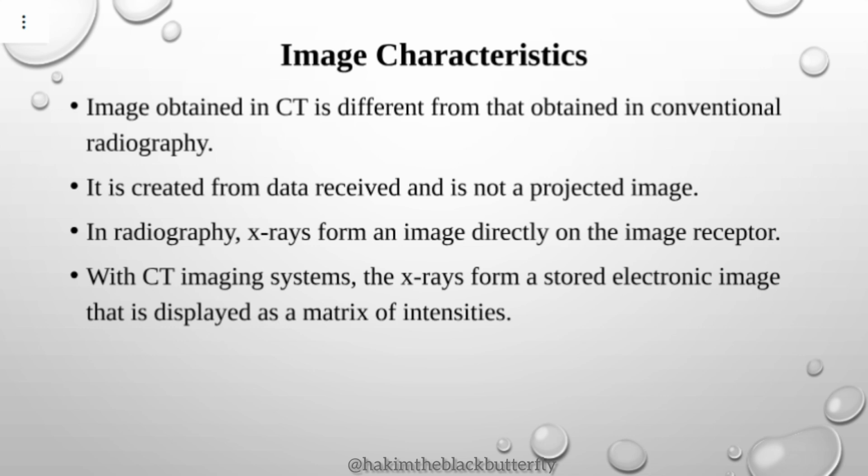Image characteristics. Image obtained in CT is different from that obtained in conventional radiography. That is what I was talking about in the beginning. It is created from data received and is not a projected image. Images produced in CTs are not projected images.